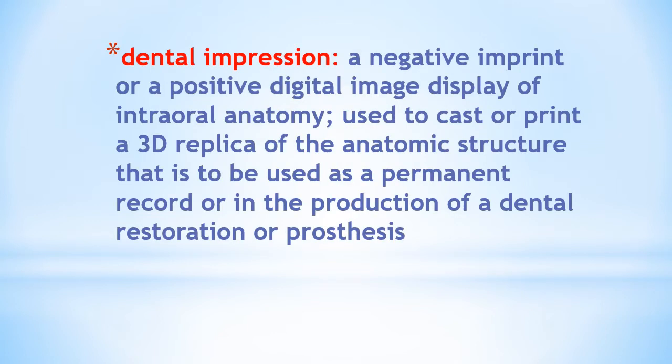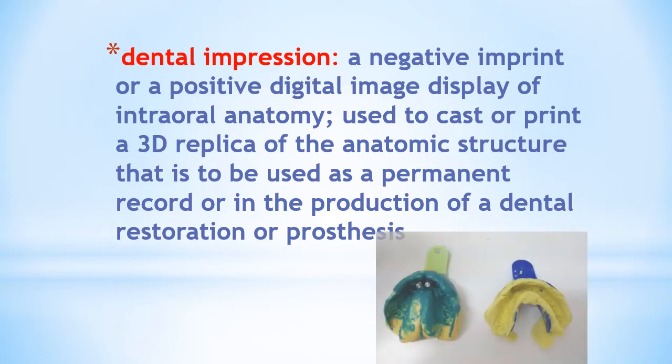Dental impression is a negative imprint or a positive digital image display of intraoral anatomy used to cast or print a 3D replica of the anatomic structure that is to be used as a permanent record or in the production of a dental restoration or prosthesis.